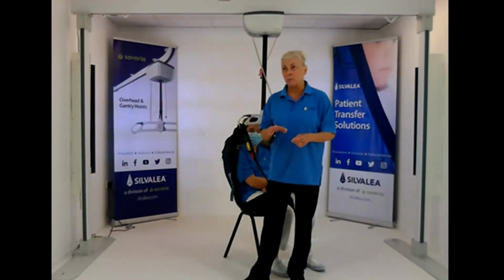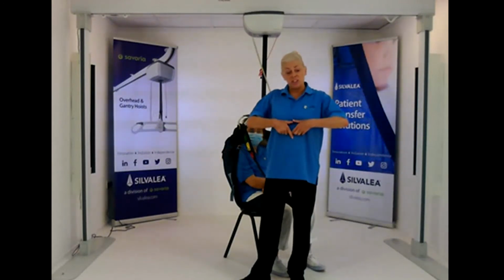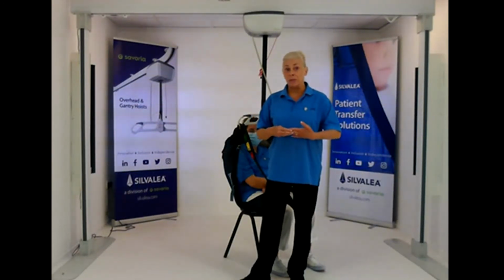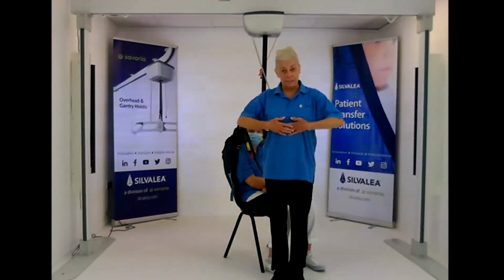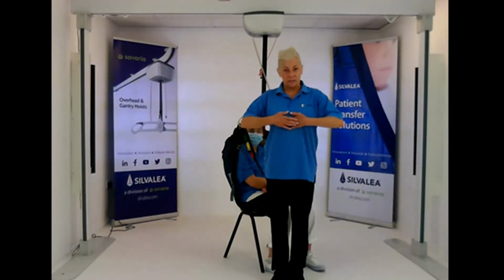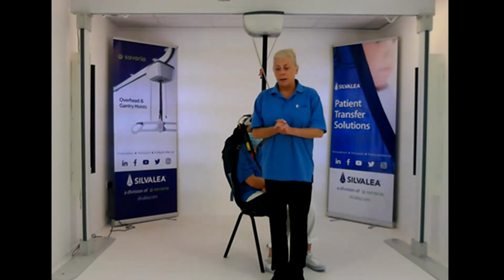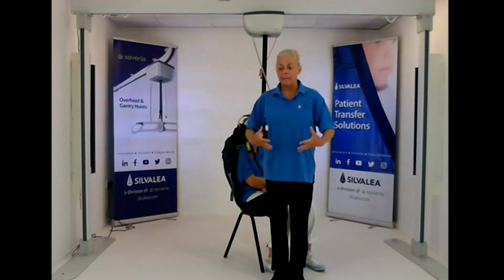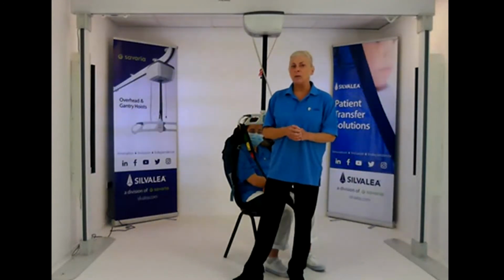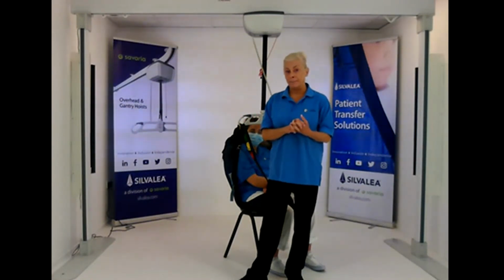We've got to be careful we don't restrain them. So it's a balance, but we can put chest straps in the slings. So you could, just to keep them safer and the sling with them, have it at chest level, which would be under the bust for a lady or a youngster, on the chest for a gentleman, or a waist strap, which will keep the sling all together. Certainly, we've got harnesses that will keep the sling on, but we'll look at the Tinkham, and maybe that may be another idea for you. So bear with us on that one for a minute.